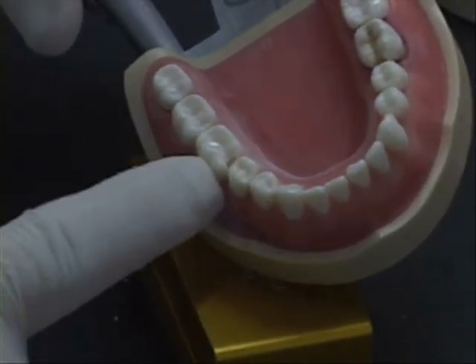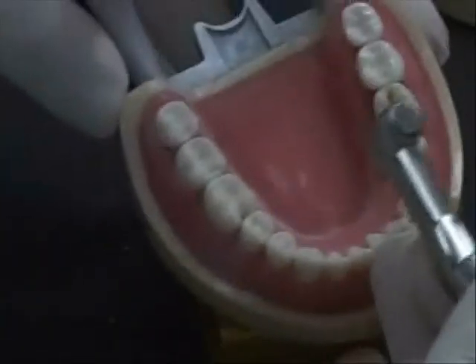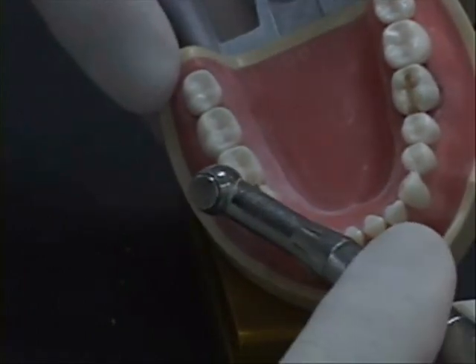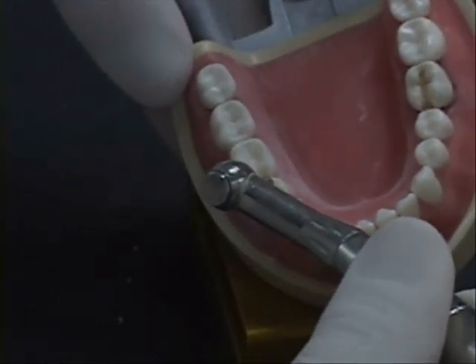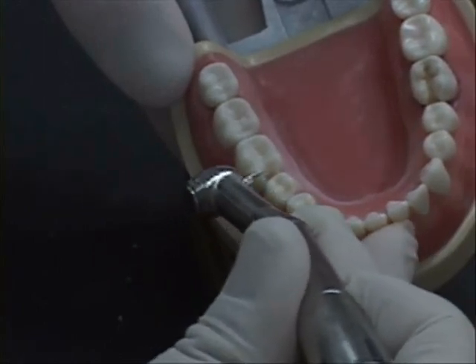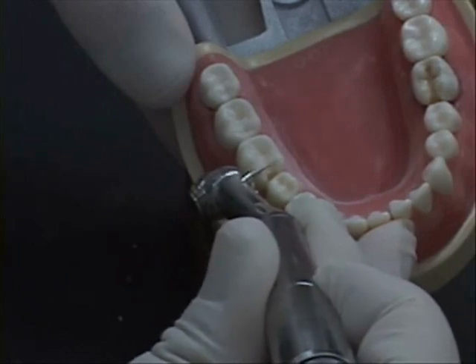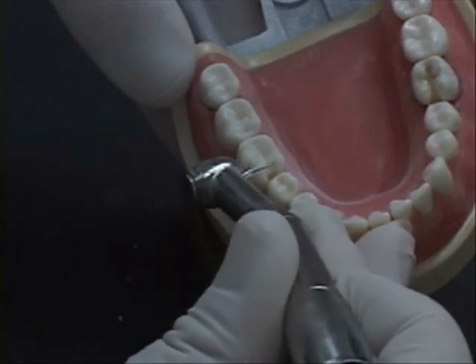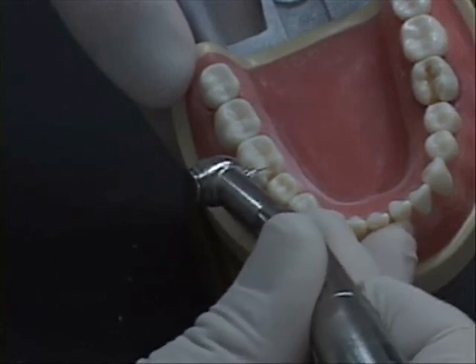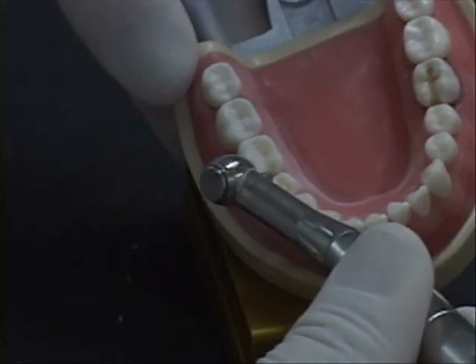The next part we have to do is we need to make our retention grooves. If you're doing retention grooves, we normally get a 1/4 round burr, and we'll go in here, and then we'll go cut across the lingual wall. Now, you want to be careful that when you cut your lingual retention groove, that you don't cut it just straight across. Remember, your DEJ is curved here. So this is an extension of your DEJ, which means that you may go lingually but slightly axially here.